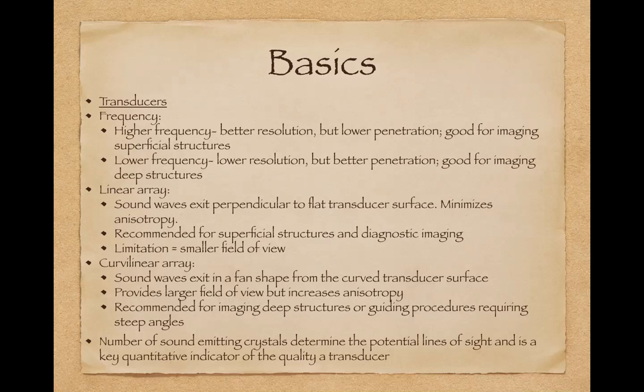One key factor, a quantitative indicator for the quality of a transducer, is the number of crystals. So when comparing transducers, a good question to ask is, how many crystals does this transducer have?